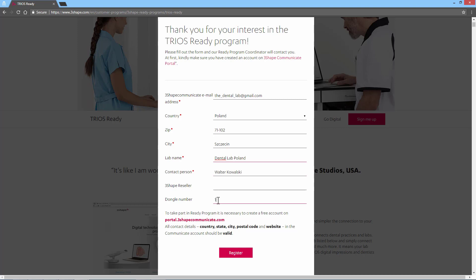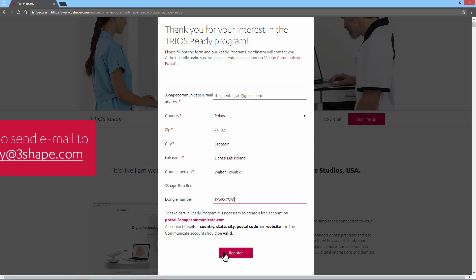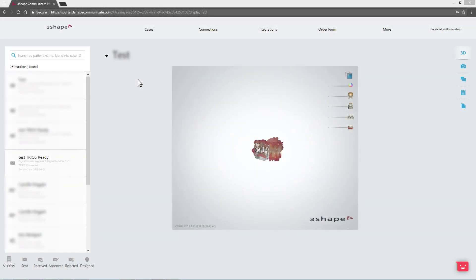You also need to have an active 3Shape dongle with relevant 3Shape software to sign up for the TRIOS ready program. Once you are ready, click on the Register button to register. If you don't want to register via the website, you can also send an email including all the necessary information to trios.ready@3shape.com. If you signed up via the website or email, a request for a connection will be sent to your 3Shape Communicate account.